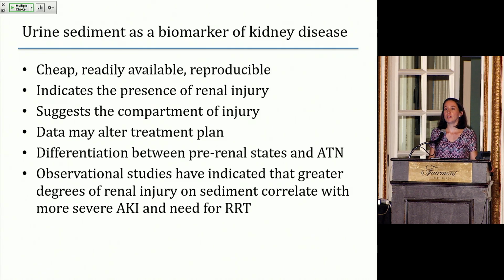I think it's helpful if you think about the urine sediment analysis as a biomarker, because as nephrologists, we always complain that creatinine is a very poor biomarker of kidney function. The cardiologists have troponin. If we had something a bit more sensitive, we might be able to pick up kidney problems earlier. But the urine sediment can tell you nicely what's going on in the kidney, and it can give you some information about the compartment of injury. With all this, I will add the caveats of its sensitivity and specificity, but when we see some abnormalities there, it can be helpful.